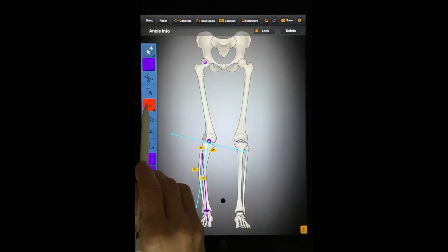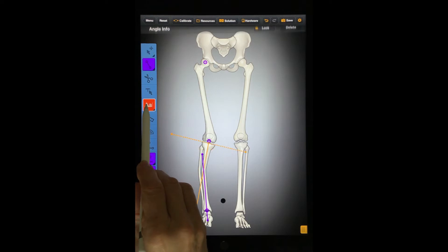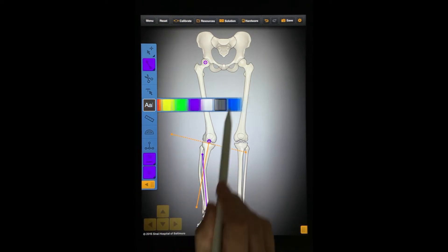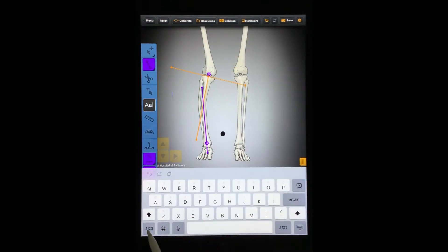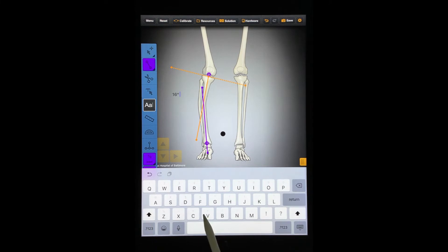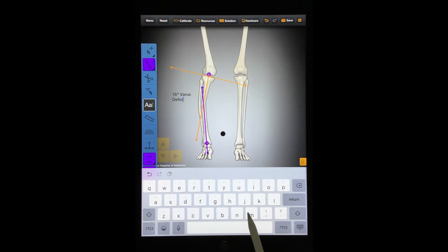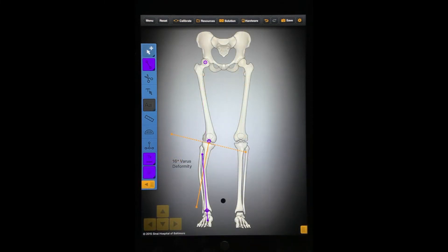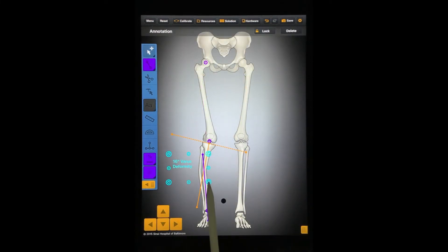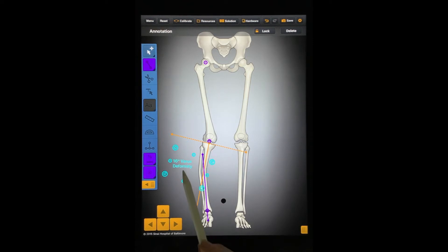The Annotations tool allows you to write text on the image. You can press and hold the button to choose the color of the text. These notes can later be selected with the Select tool and then moved, rotated, locked, or deleted.